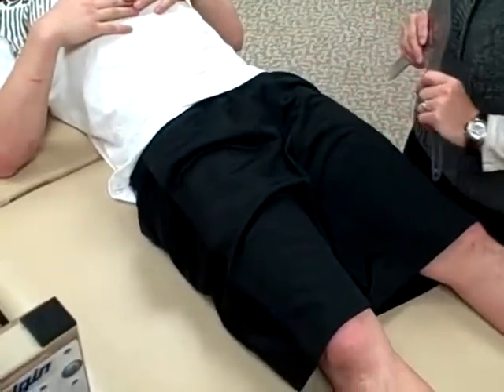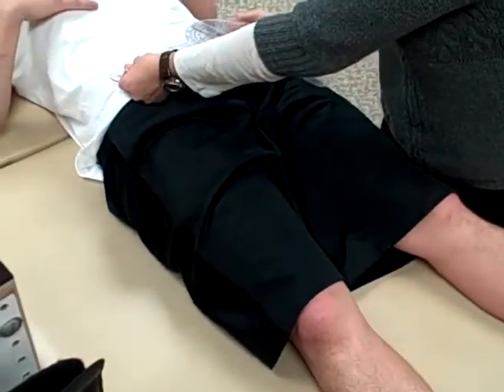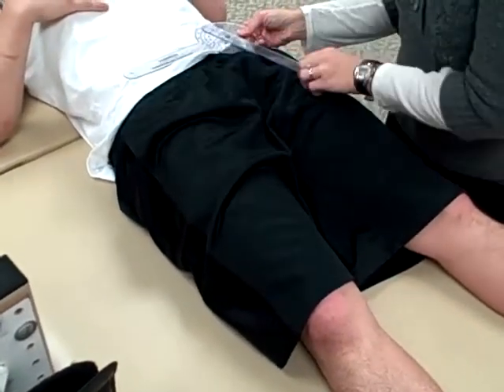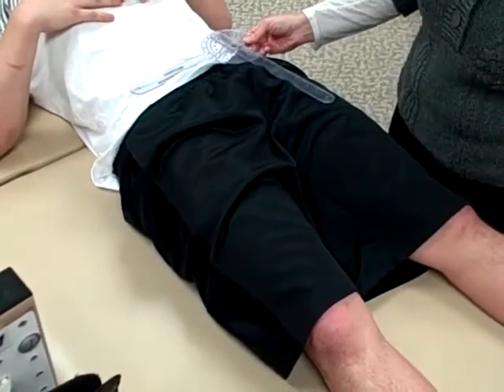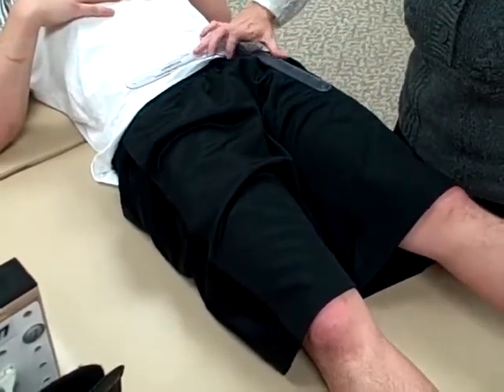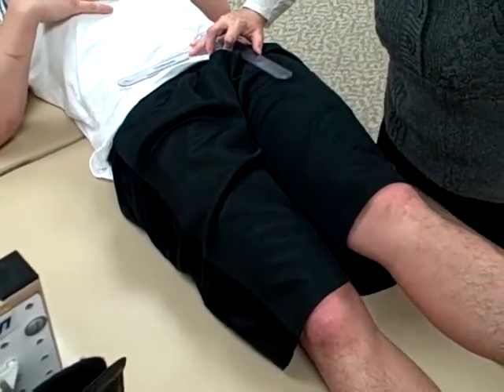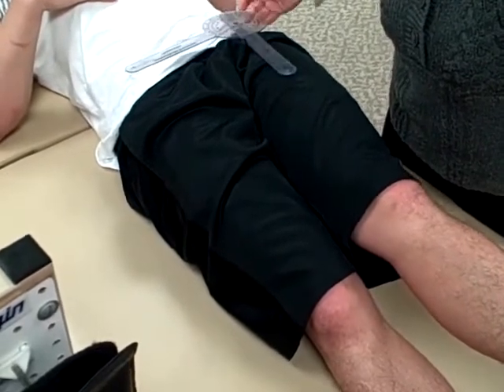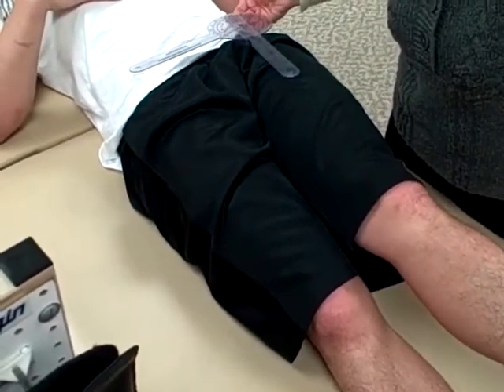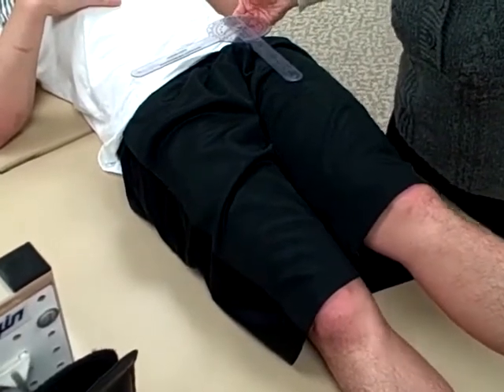Alright, to measure hip adduction, again, supine position, axis is the same as abduction, ASIS. Stationary arm is the line connecting the left and right ASIS. Your movable arm is parallel with the long axis of the femur. Again, you start from neutral, so the goniometer reading 90 degrees. That's your starting point. You adduct the hip across the leg to the limit of motion, and your normal range is from 0 to 20 to 30 degrees.